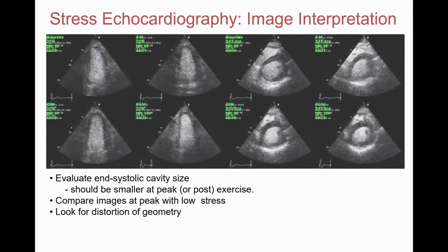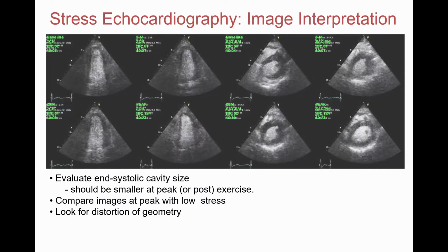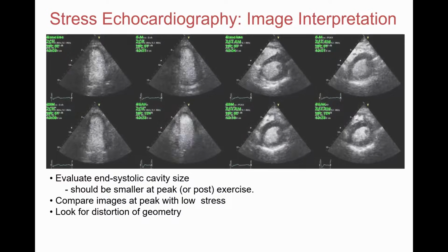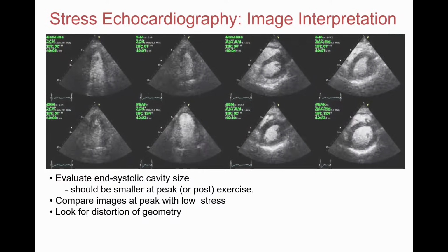What about this one? This one is interesting. I don't know if you can all pick it up. I'm not going to try that trick of magnifying anymore. Let me just get the laser pointer.